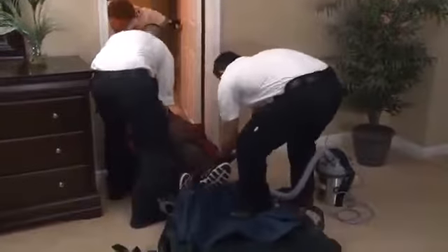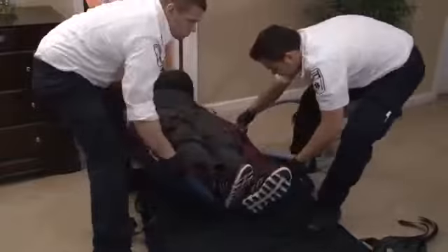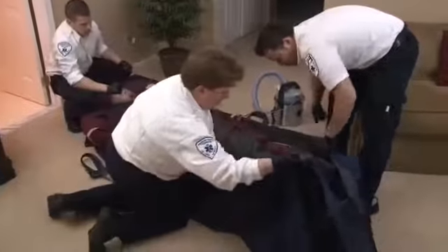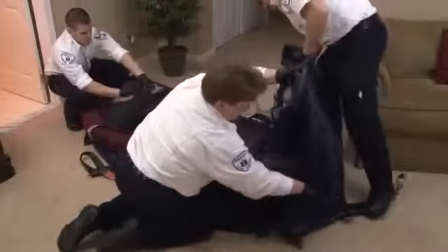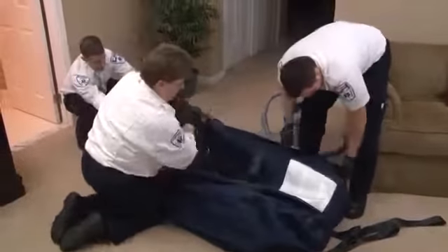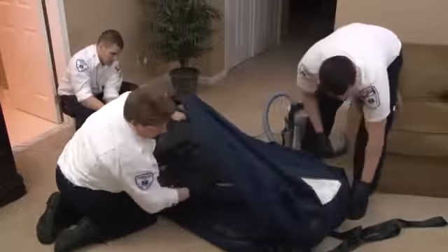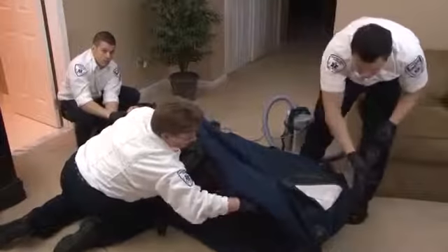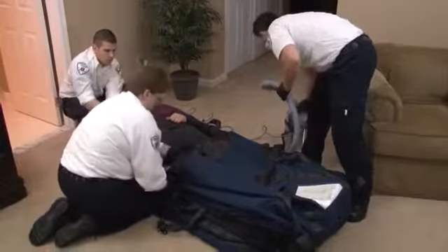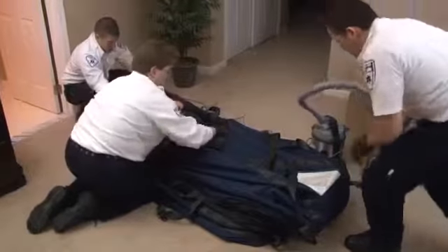Make sure that the patient's head is below the head end seam of the device and that the patient's body is centered. Deflate the HoverMatt and disconnect the air supply hose. Buckle the HoverMatt and Evacuation HoverJack 2 patient safety straps loosely around the patient. Be sure to leave some slack in the strapping prior to the inflation of the device, as the straps will tighten slightly after inflation. One caregiver should be positioned near the patient's head, holding a transport handle to reassure the patient and to ensure stability, while the other caregiver remains at the foot end to inflate the Evacuation HoverJack 2.